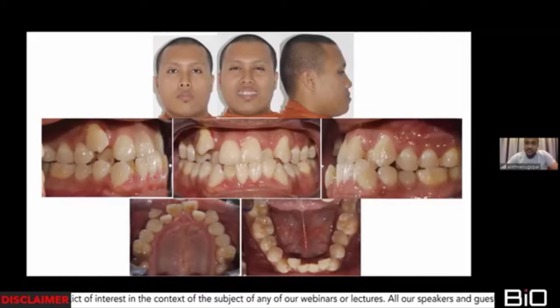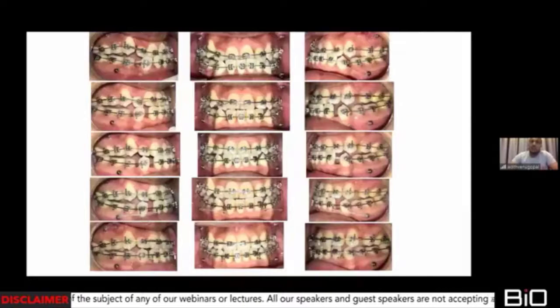He has a very similar malocclusion to the case that I showed you 3 cases back. I've used the regular conventional brackets on him. Placed mini screws from day 1, extracted day 1, started retraction on a light niti. And as you can see, I've placed the mini screws on the lower. I've started retracting on a heavy wire.